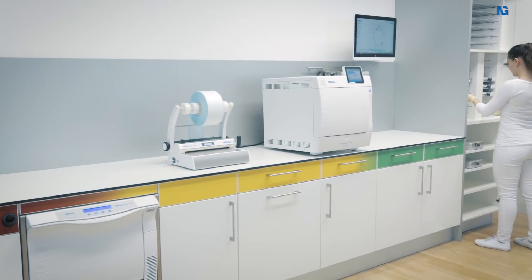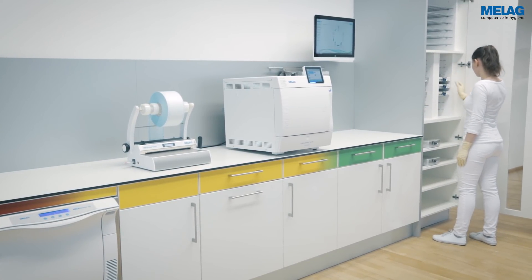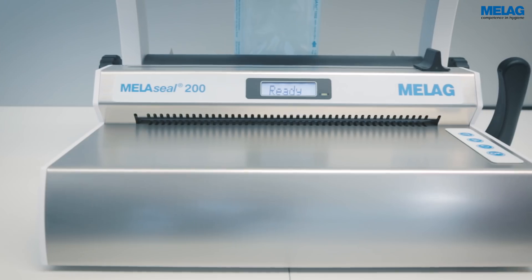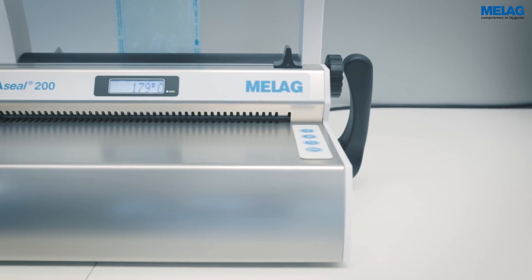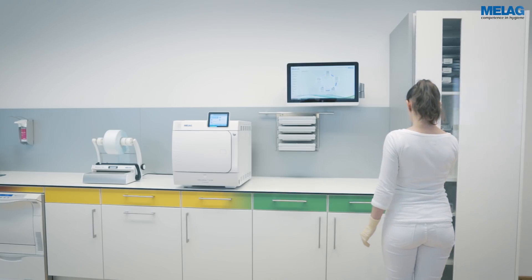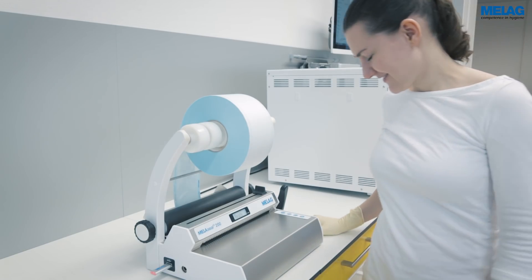The date and time must be set to ensure that the sealing procedure is logged correctly. The MieleSeal 200 is set to Central European time. Proceed as follows to adjust the settings.